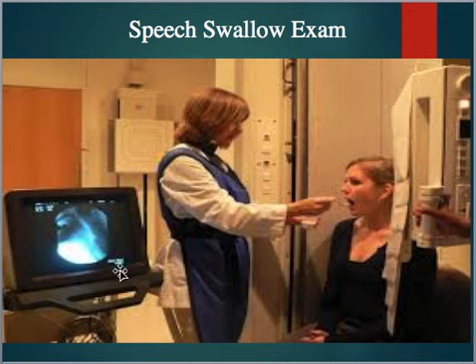And what we're watching for is if that patient aspirates any of that during the exam. Now, if they do aspirate, it's very small portions, so it's usually not enough to where that patient would need a bronchoscopy. But these are fairly common, especially in patients who've had a stroke, so they've lost some of that motor function. They can see if there's ways that they can eat, or they can say, you know what, you need to thicken all your food. Anything that's thin, you're going to aspirate, so you need to thicken it, or vice versa.